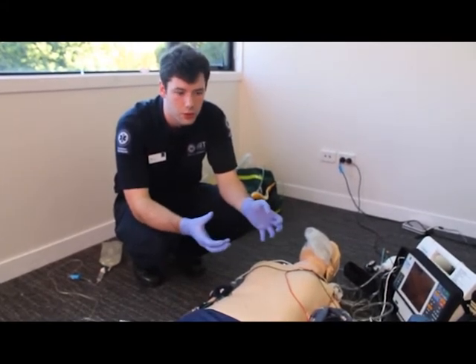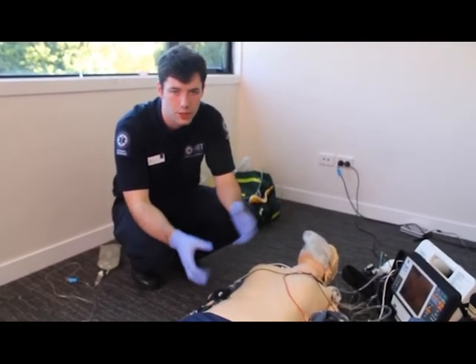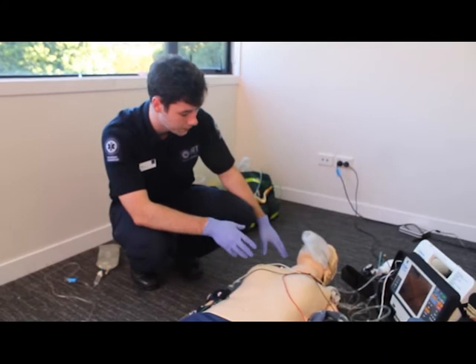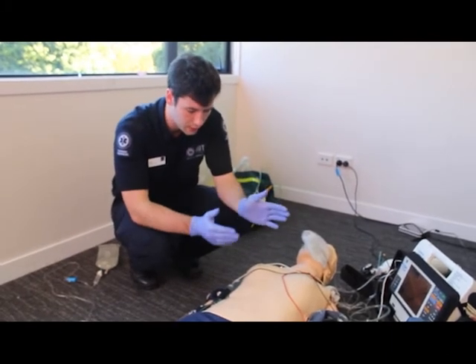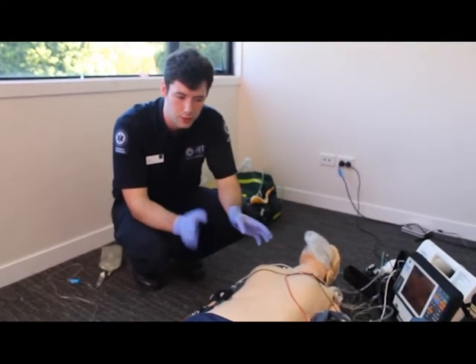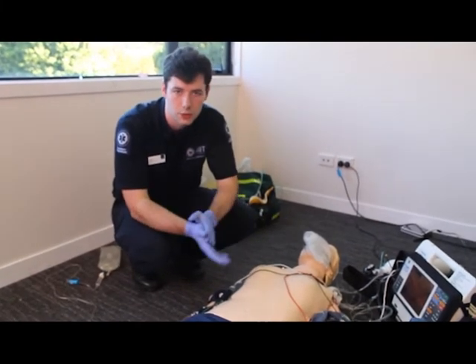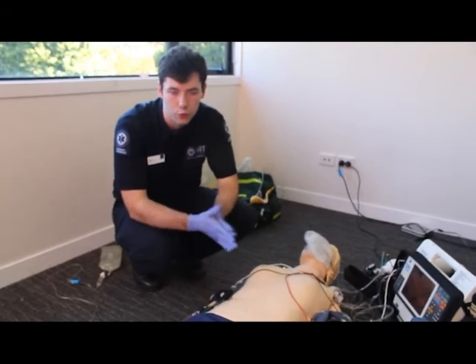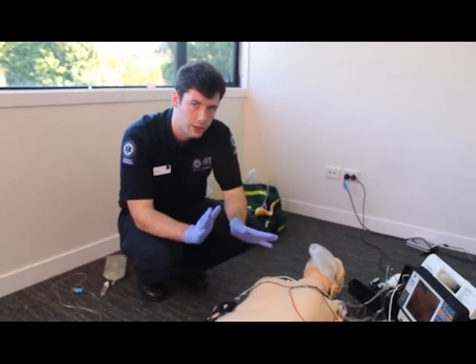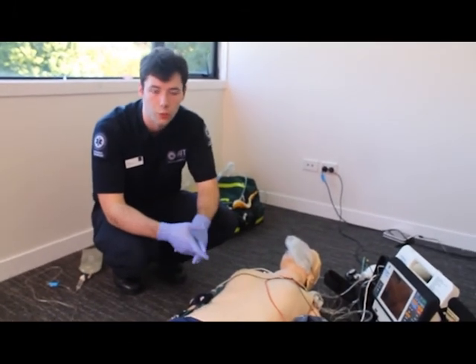The ICP might then go on to look at some reversible causes about how to manage the failed intubation, and might reposition the airway. They might get you or their assistant to provide some pressure. They might then have one more go, and if that's not successful by the similar criteria as before, or the patient's end-tidal CO2 is less than 5 millimetres of mercury after 2 to 4 breaths, then it's considered another failed intubation, and then we have no more attempts at intubating the patient, and we swap back to an alternative airway such as an LMA or an OPA and bag valve mask.